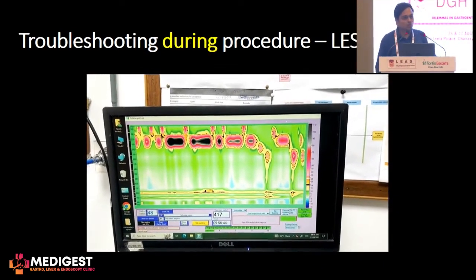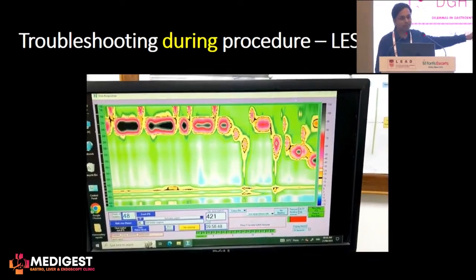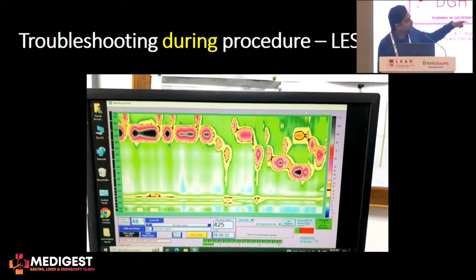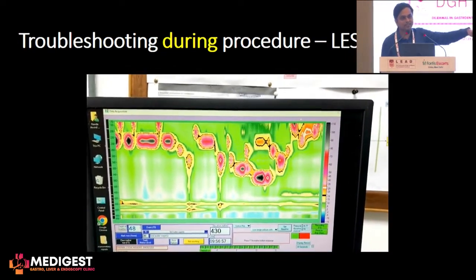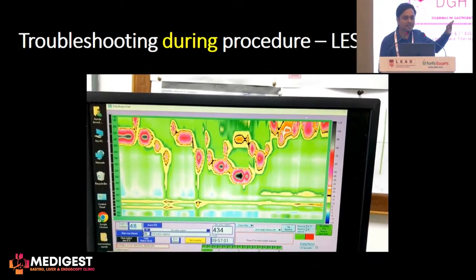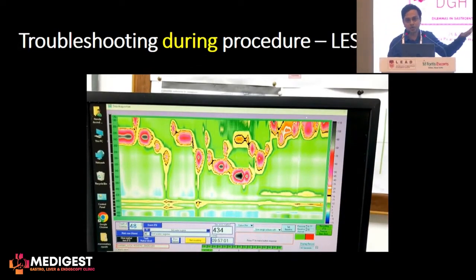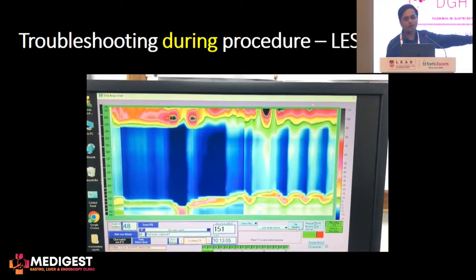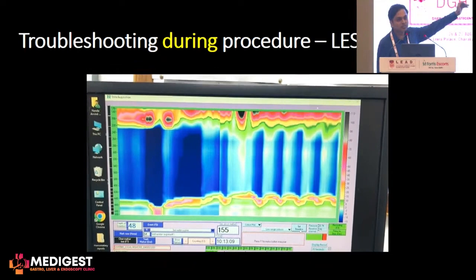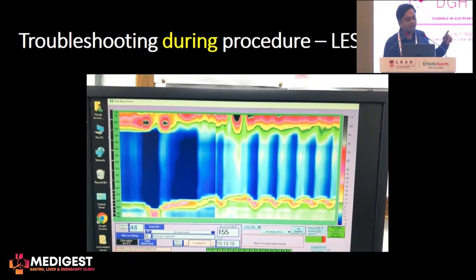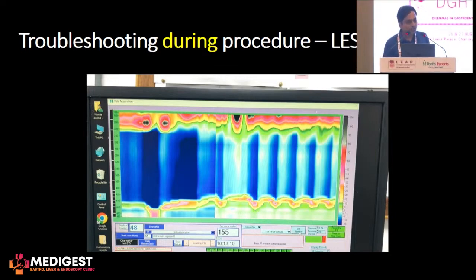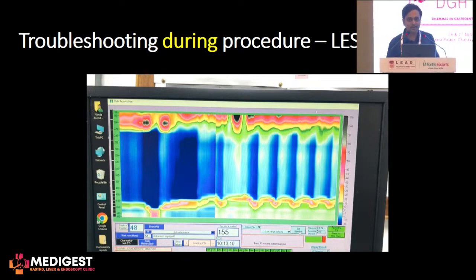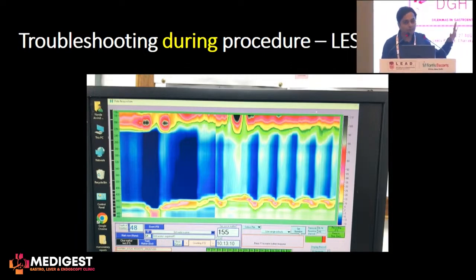The next most important step is to localize the lower esophageal sphincter (LES). If the catheter is moved in and out but the upper esophageal sphincter moves while the suspected LES signal stays at the same spot, this is not the true LES — it is probably an artifact from a blocked catheter channel. A correct LES localization means the distance between the upper and lower esophageal sphincters remains intact irrespective of catheter movement, and there is variation in LES pressures with inspiration and expiration — darker blue areas show inspiratory augmentation and light blue areas show the LES pressures decreasing on expiration.